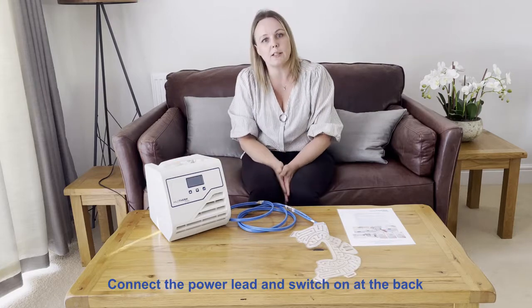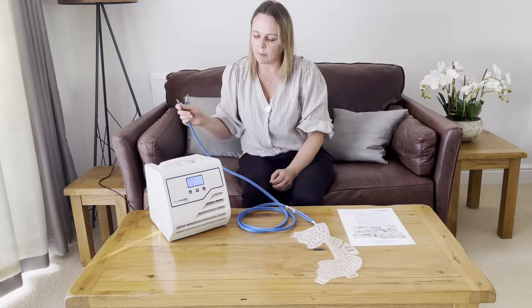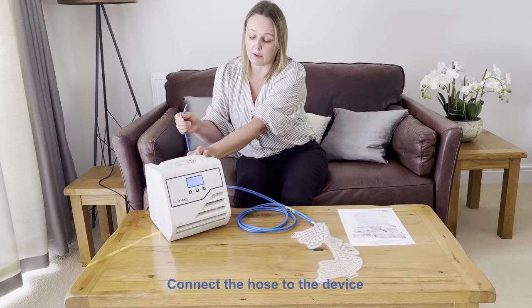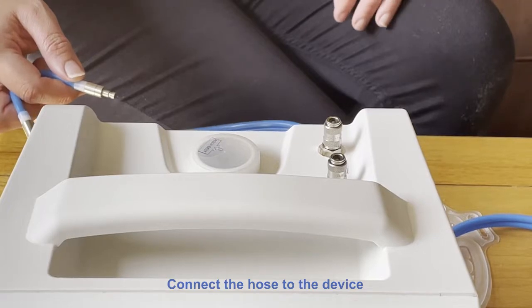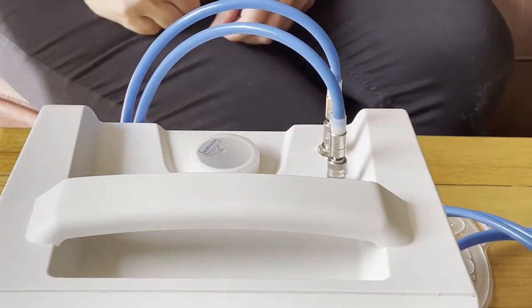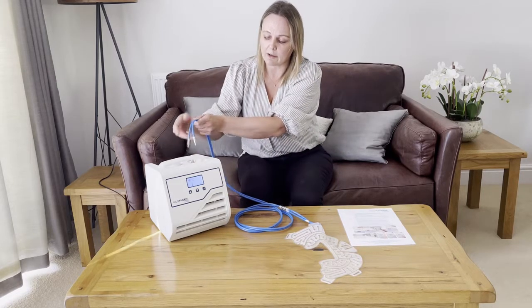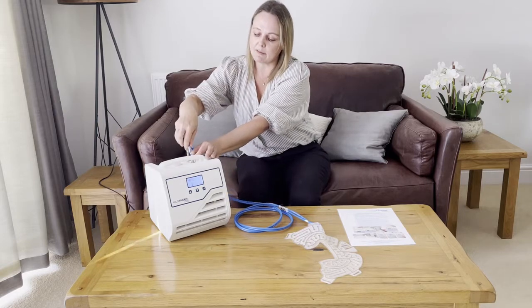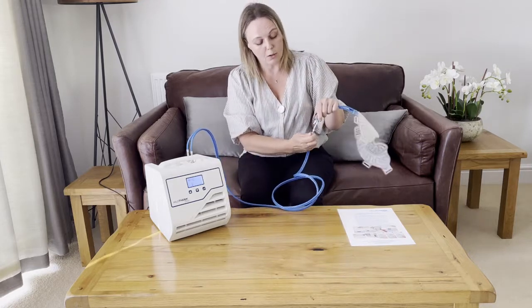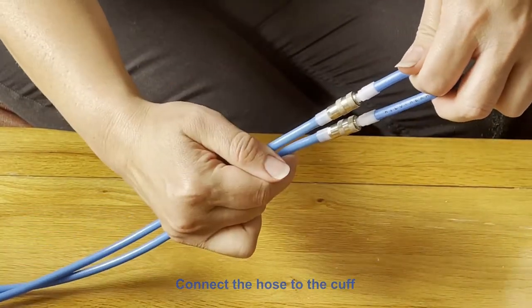Once you've done that, turn the device on. Connect the long blue tubing, which is called a duo hose. The connectors on the top have an outer metal collar — push down the outer metal collar, place in, and release. For those working in hospitals, this is connected in a similar way to a blood pressure cuff. To disconnect, just press down on the outer metal collar. To connect the cuff, pull down and push onto the cuff; to release, pull down on the outer metal collar again.